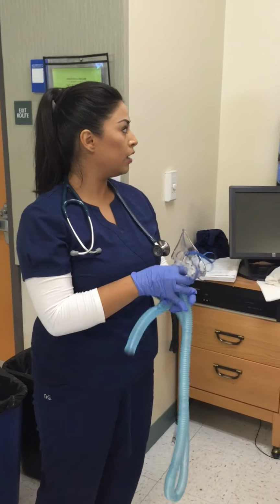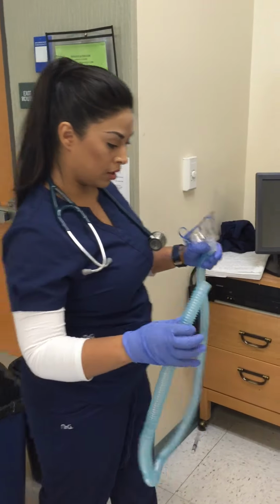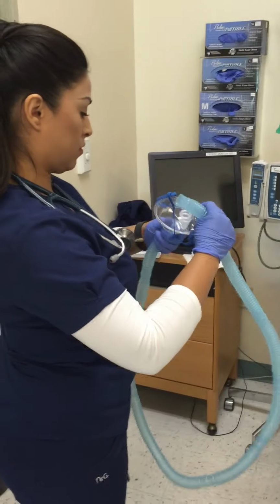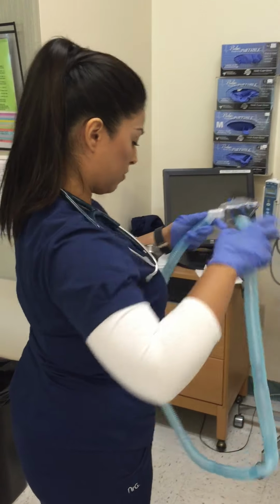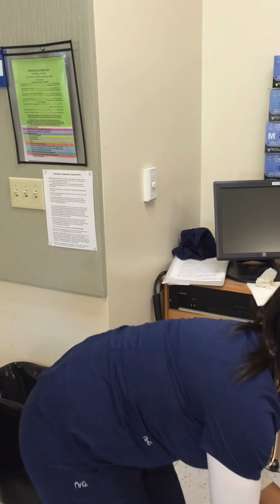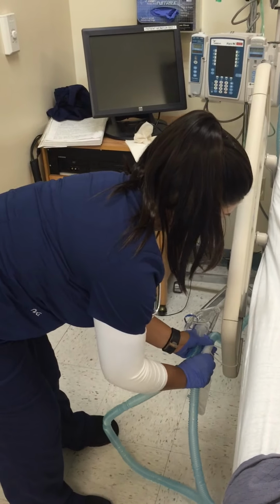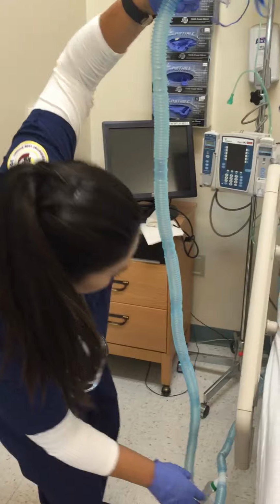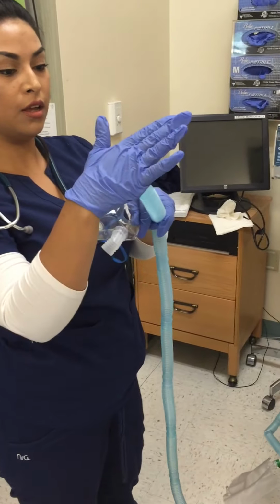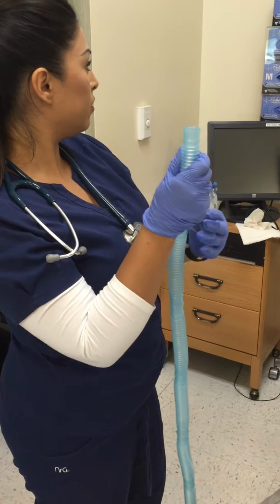Before attaching this, I want to make sure my tubing is all connected while maintaining sterility, and that I see some aerosol coming out.